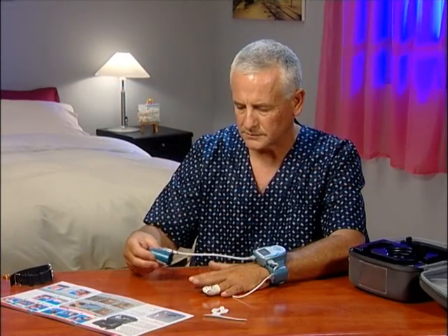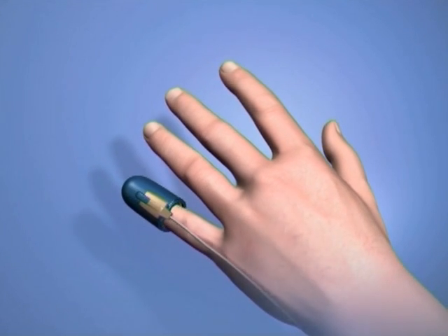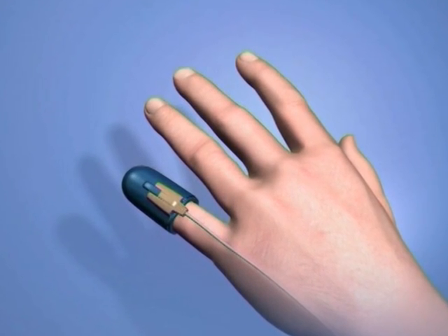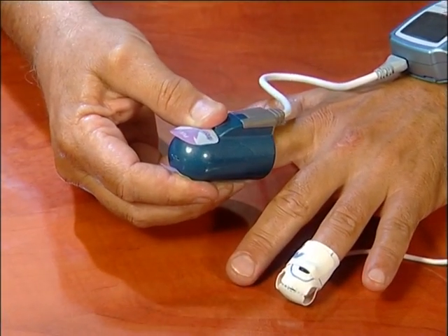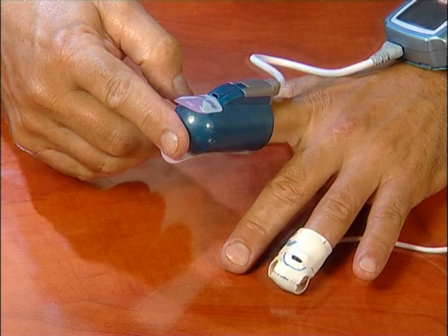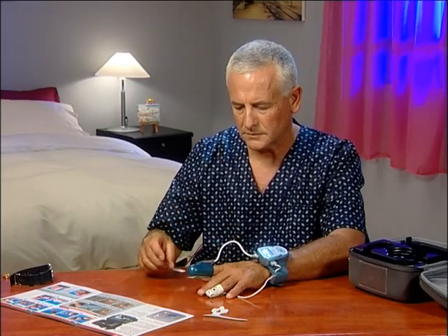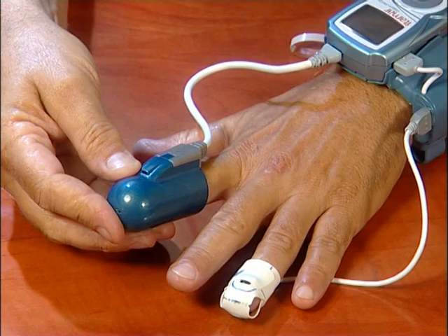Place the PAT probe on your index finger. If your index finger is too thick for the PAT probe, you can choose another finger that fits better — for example, your pinky. Choose carefully, as once in place, the PAT probe cannot be removed and placed on a different finger. Insert your index finger all the way into the probe. The tab labeled 'top' should be situated on the top side of your finger, and the tab labeled 'bottom' should be on the underside. Gently and firmly remove both paper tabs. Be careful not to twist the probe.